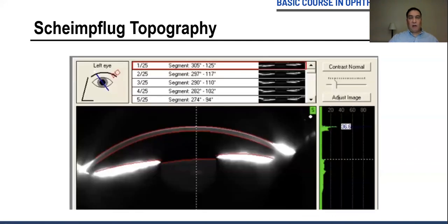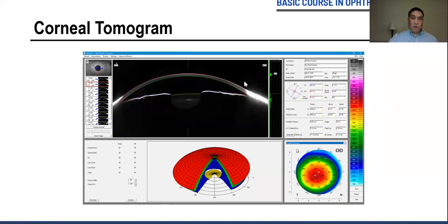Now, the Pentacam is based on Scheimpflug technology, wherein you'll have several of these images that will rotate along particular axes in the cornea. And so if you combine all of these images, you will come up with a tomographic image, like a CT scan, computed tomography. If you take this at particular axes, it will come up with a particular shape. So the red is the anterior cornea, the green is the posterior cornea, the blue is the iris, the yellow is the lens, as you can see also here.